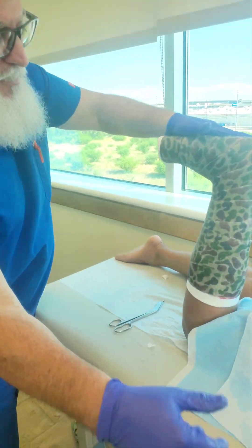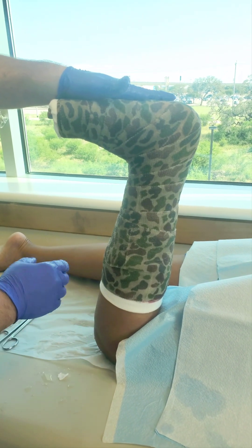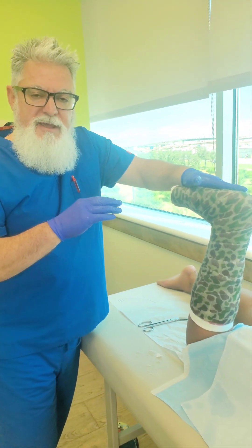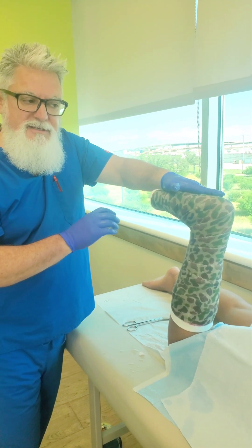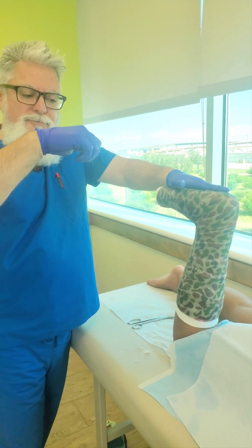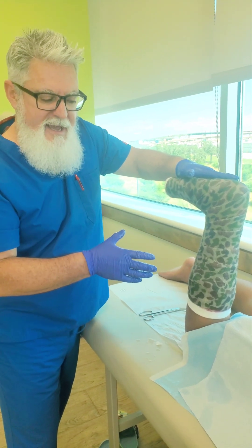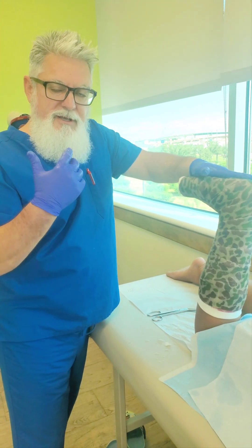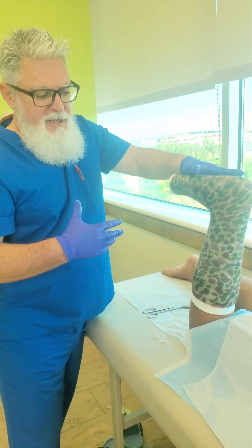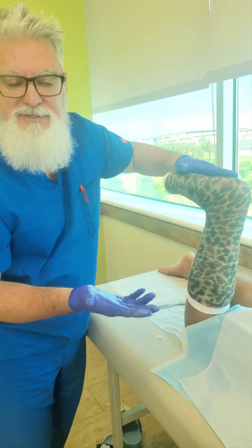Welcome back everybody. You caught us here making some short leg casts on some patients. We've been doing a series of videos on molds — the last one you may have seen was doing molds on the upper extremities: an interosseous mold, a deviated ulna, a volar mold. Today I'd like to show you some really cool molds you can do on a short leg cast that are more comfortable for the patients, more functional, and help keep the cast from slipping.